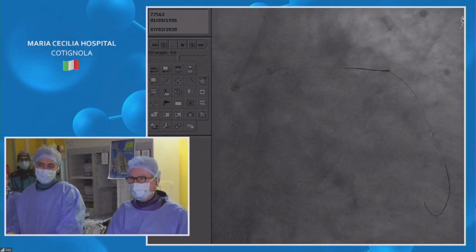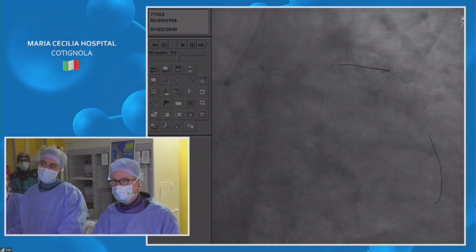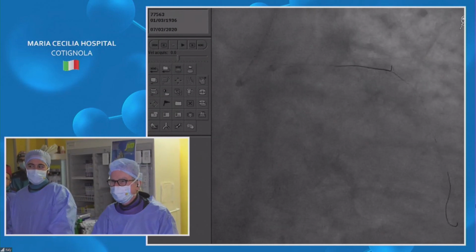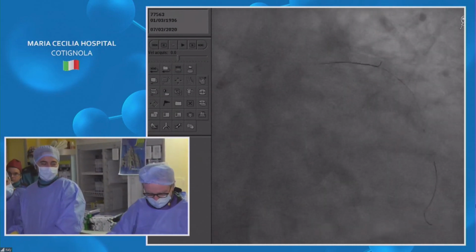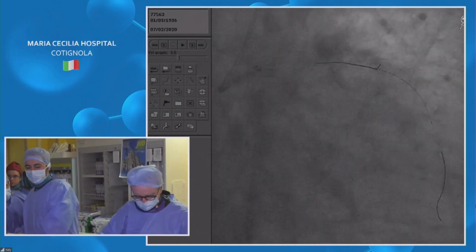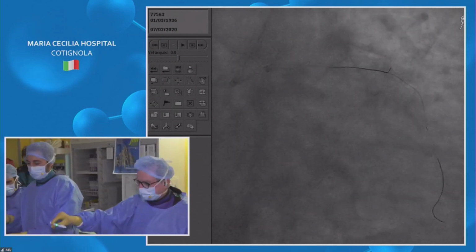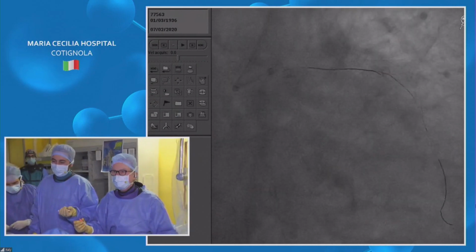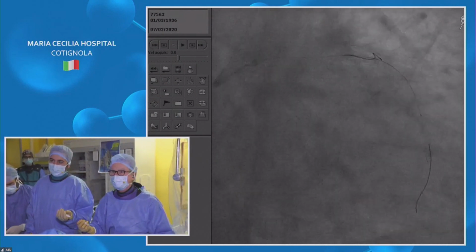It's really so steerable. I'm so glad to hear Antonio say that, you know. Why? Because you've got magic in your hands, and I thought every wire just flies when it is in Antonio's hands. No, but I tell you, the Boston FFR wire, I love it.